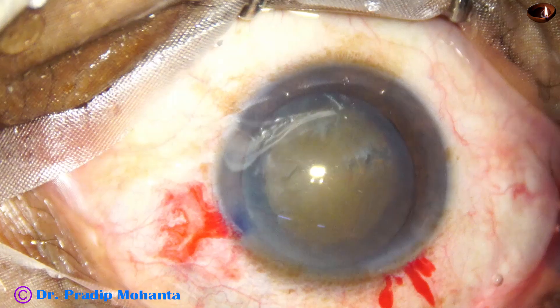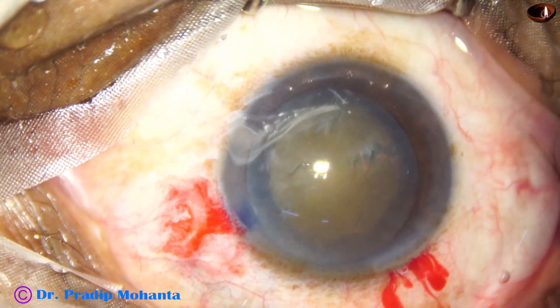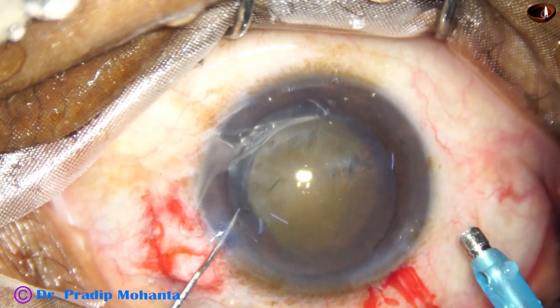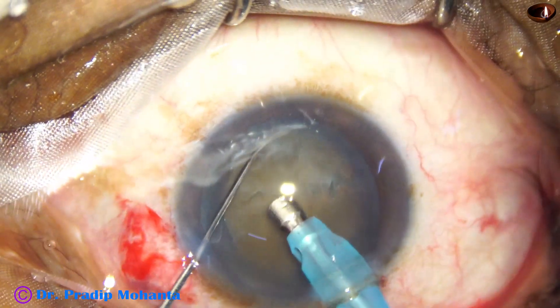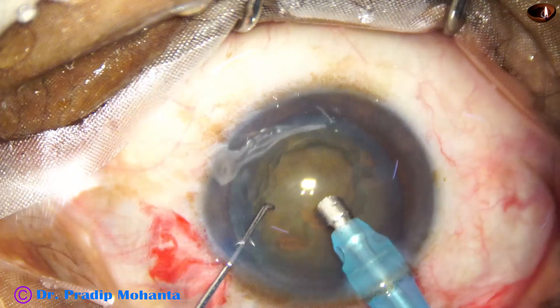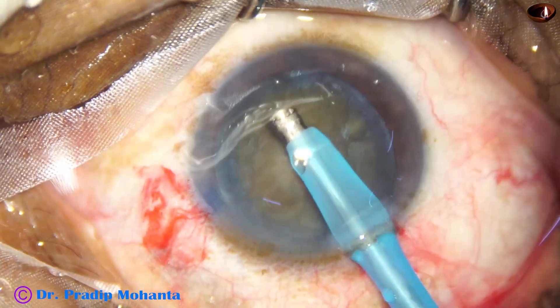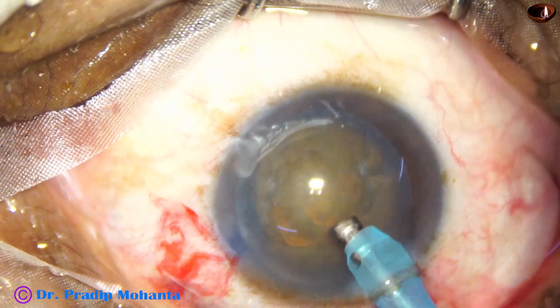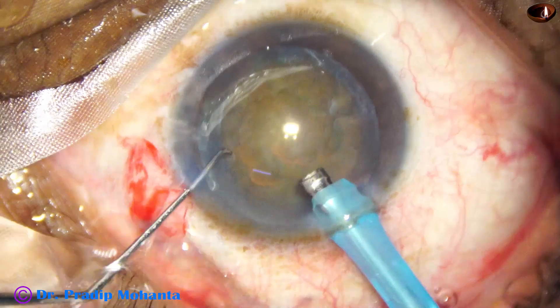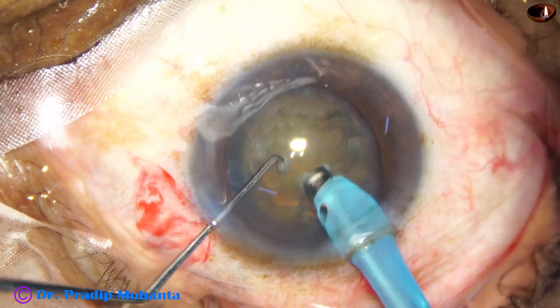Now is the time to manage the nucleus. The exposed part of the phaco needle is about two millimeters. Some superficial cortical lens matter is removed, then I turn the handpiece and make the bevel up. Now watch the submarine chop technique, where the phaco needle goes through the substance of the nucleus as a submarine moves under the surface, through the water.